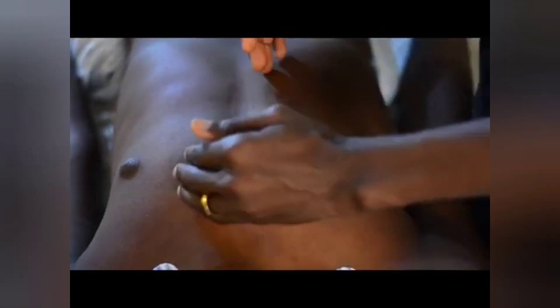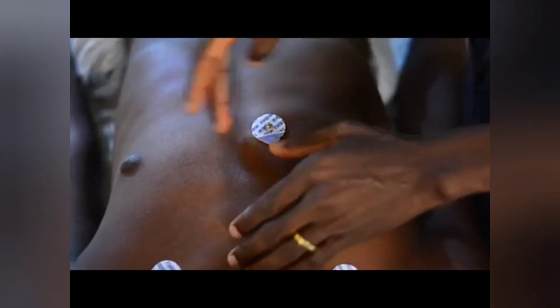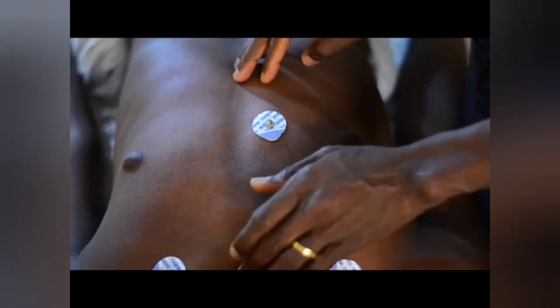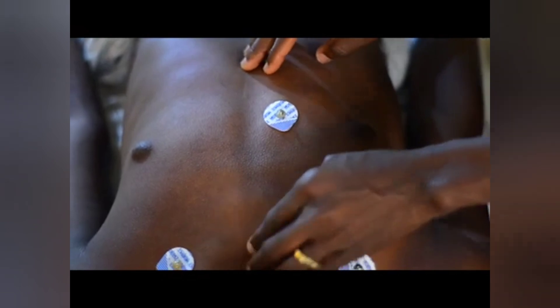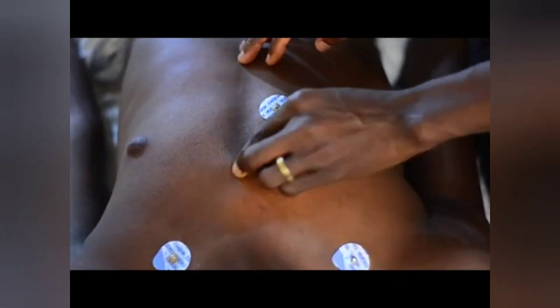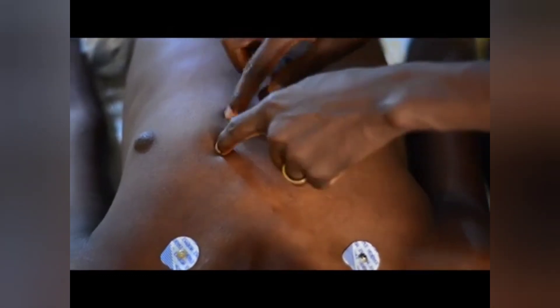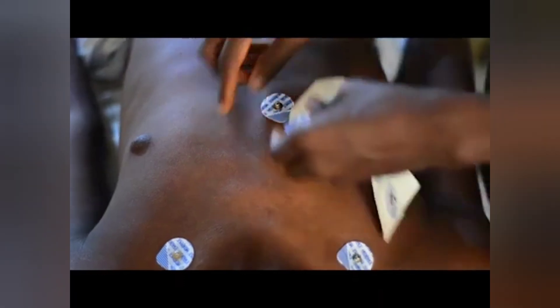V2 is on the left sternal edge of the fourth intercostal space. You cannot simply assume V1 and V2 are side by side and place V2 adjacent without checking — you have to locate your intercostal space all over again. So again: slide down from the sternal notch, find the angle of Louis, slide into the second intercostal space, then third, then fourth intercostal space — and there we place V2.